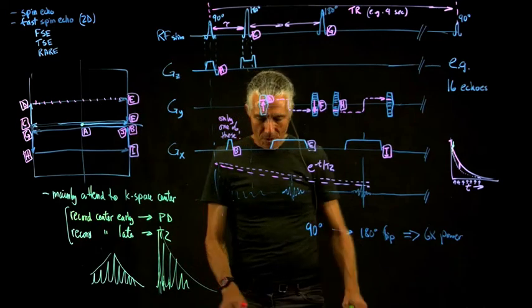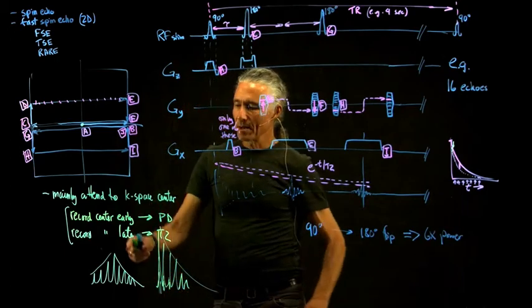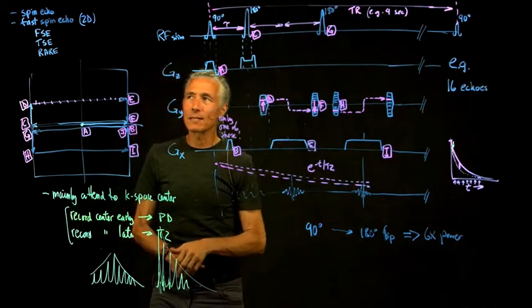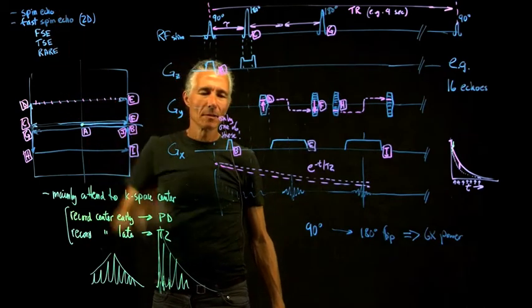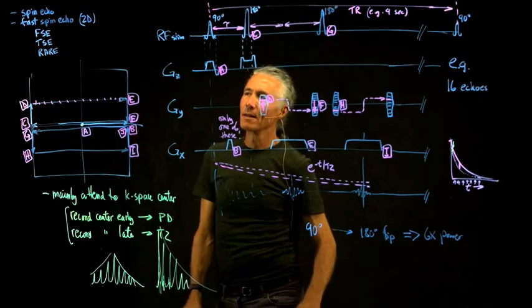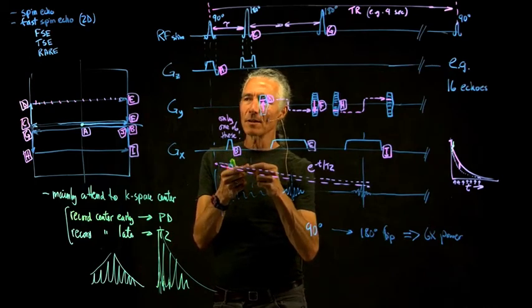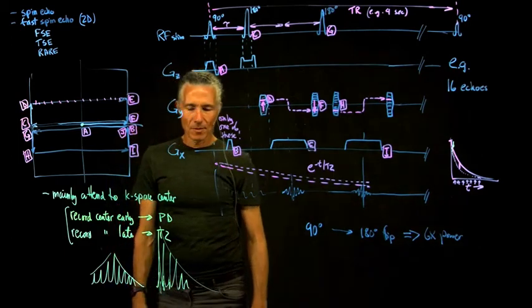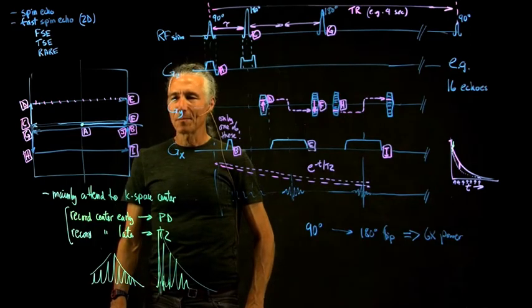So this is basically a way to get a SpinEcho image, but get a lot more data, like 16 times as much data. So it's turbo. The idea is that this will actually go 16 times faster than a slow SpinEcho. Just about 16 times faster. So that's a really big difference. And so now you could get it down to a 5 or 6 minute scan at a reasonable resolution. It's still not, typically the slices are still going to be relatively thick, but they're going to be much quicker to collect and much more usable for the subject.